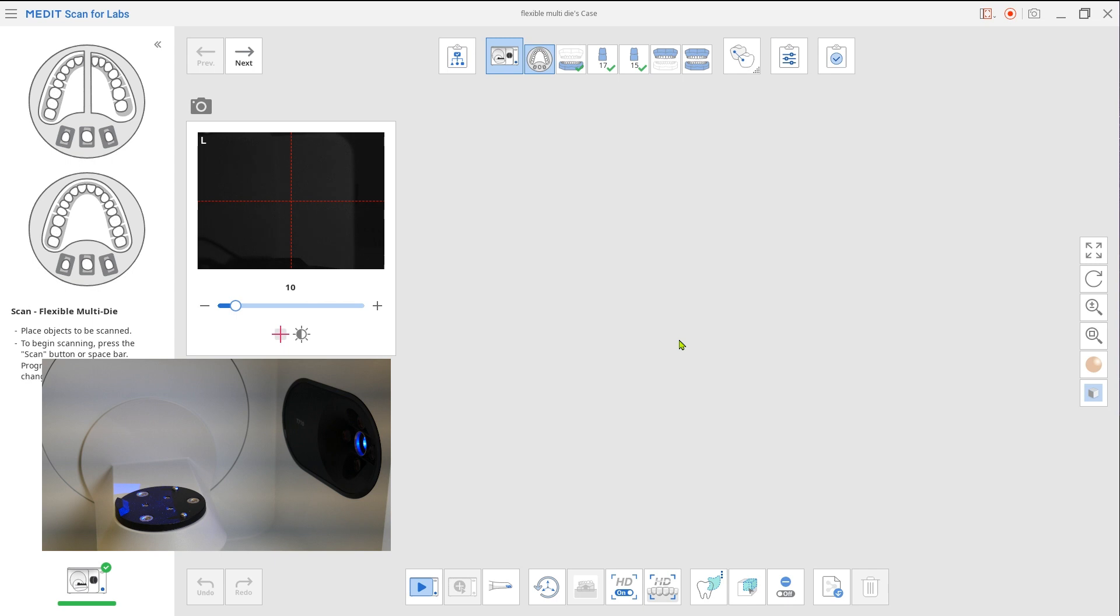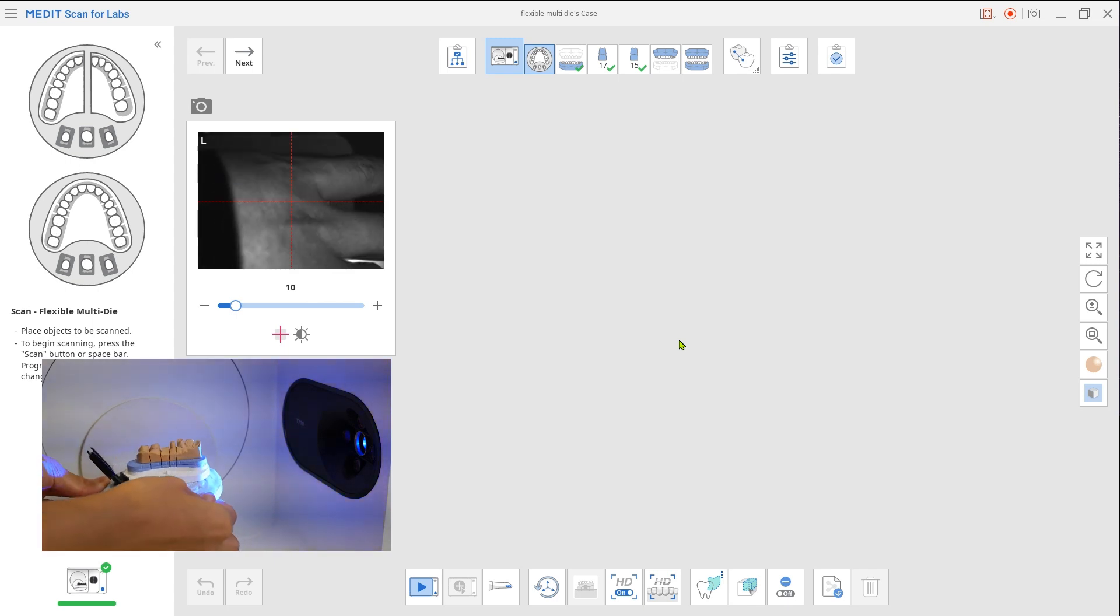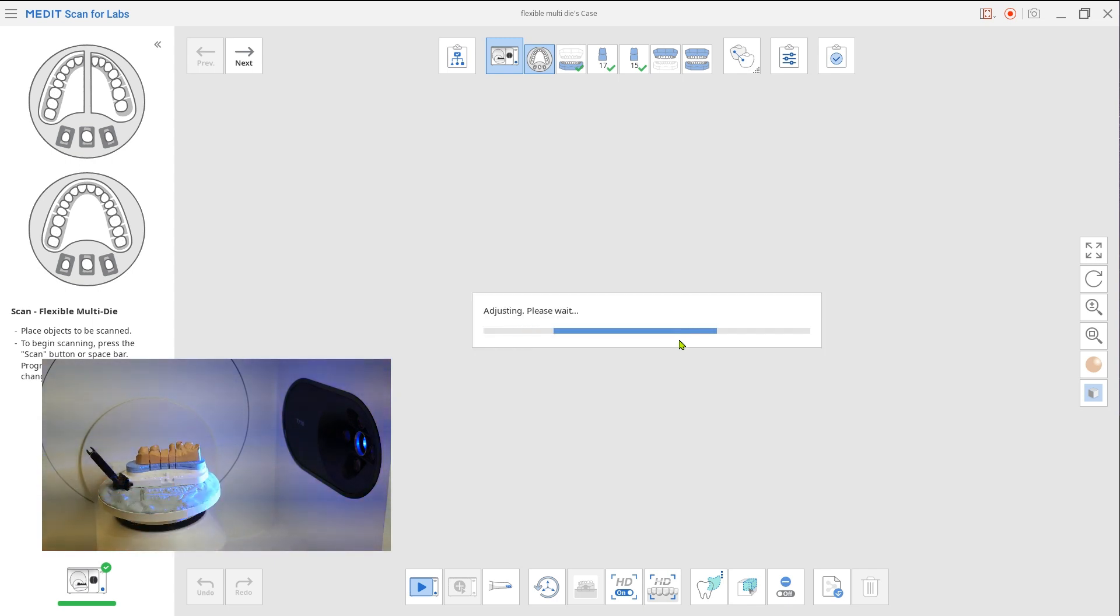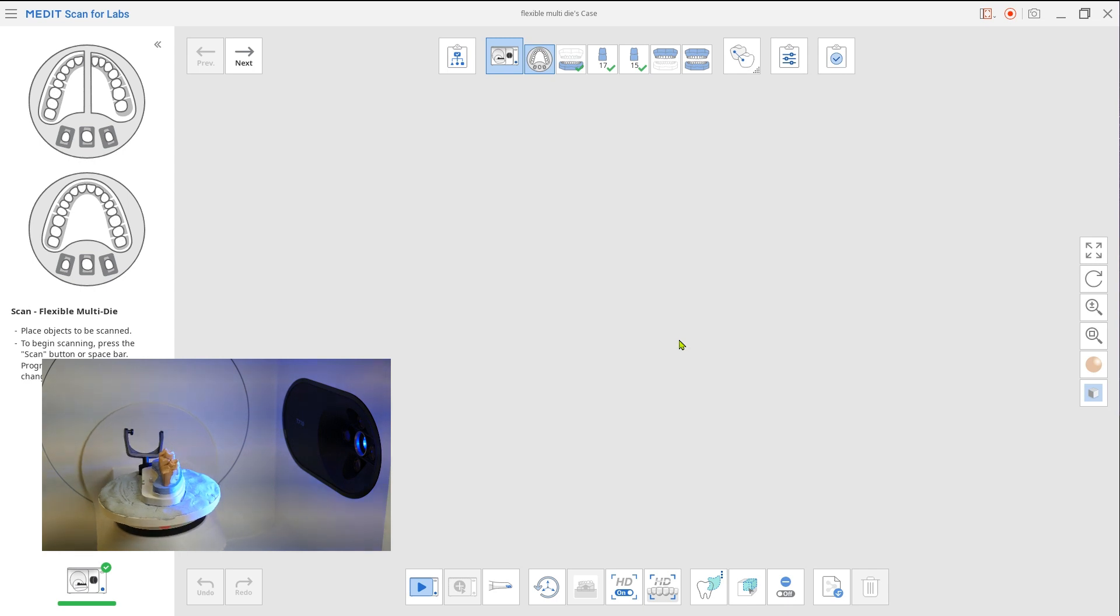Now the scan stage will go back to multi-die scan step. Place the maxilla and perform the scan.